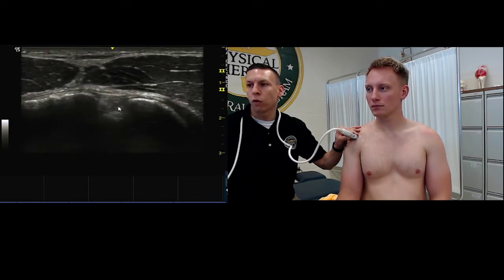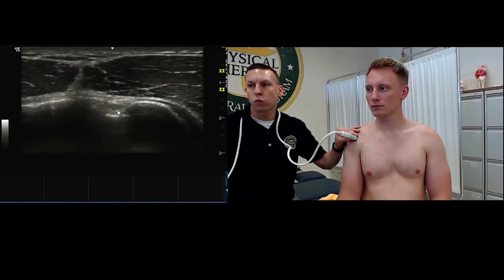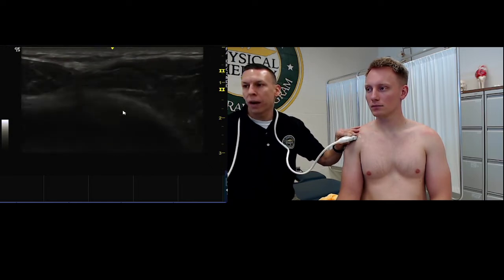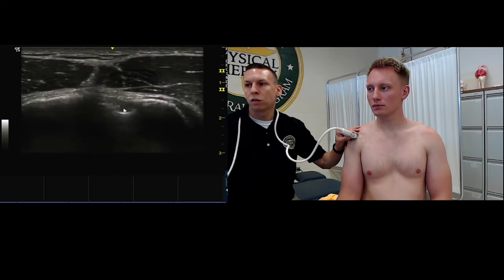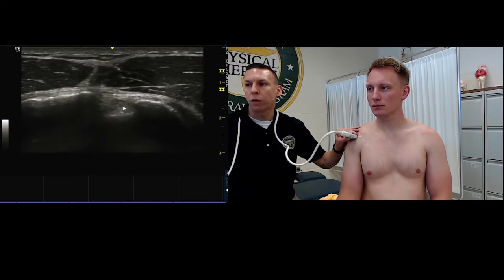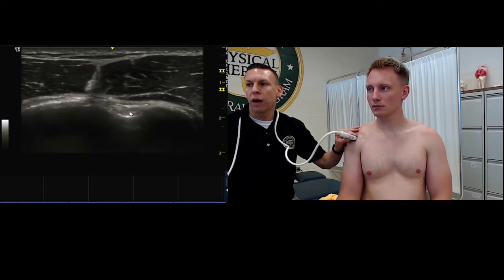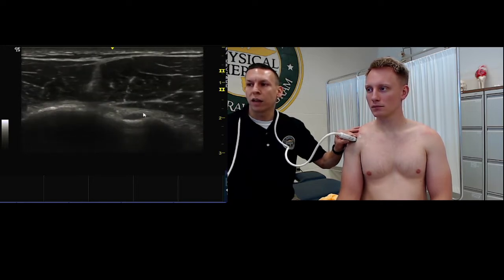The first one we're looking for is the biceps tendon, which is going to be in this groove. The easiest way to identify it is to take your probe and toggle up and down like this, making smaller motions. You should see a hyperechoic structure appear and then become hypoechoic. You want to make sure you do that throughout. And we're looking for any kind of fluid around this tendon, but it should stick out between that and the other connective tissue that's around it.